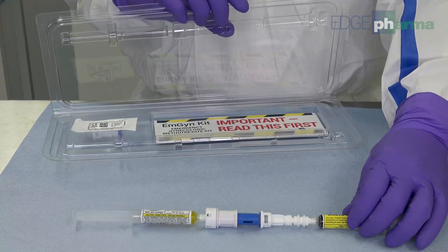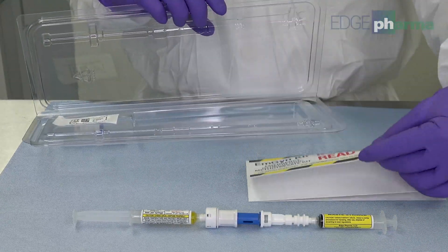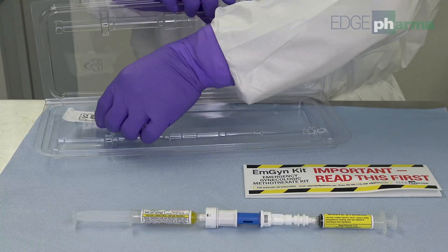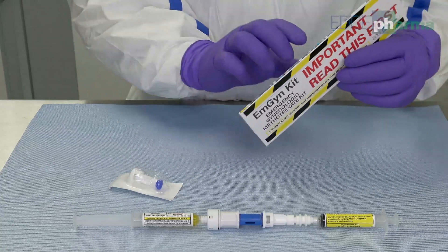Open the EmGyn Kit and remove the contents. Please read the included instruction pamphlet.